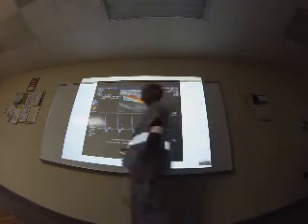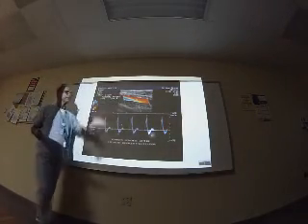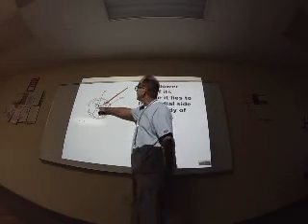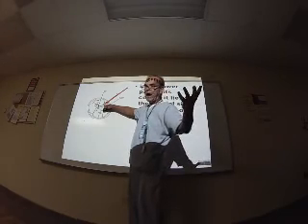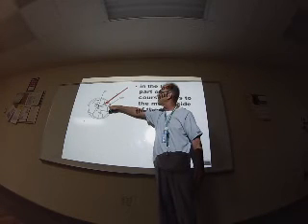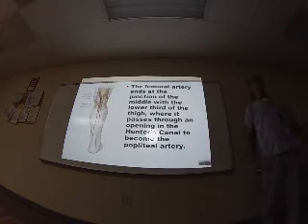A spectral Doppler is used to measure the velocity of the blood. In the lower part of its curve, it lies on the medial side of the body of the femur. This is the deep femoral. This is the superficial femoral. This is the great saphenous vein, which is superficial. The great saphenous vein is superficial.